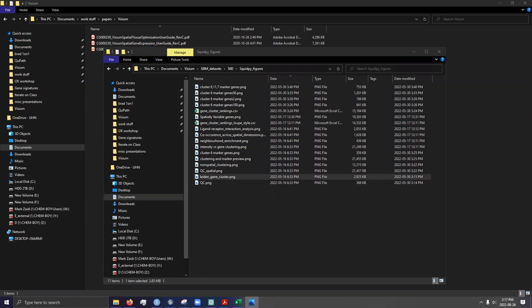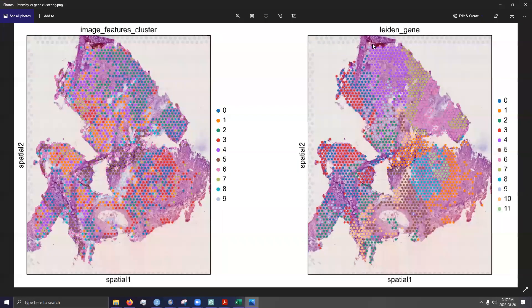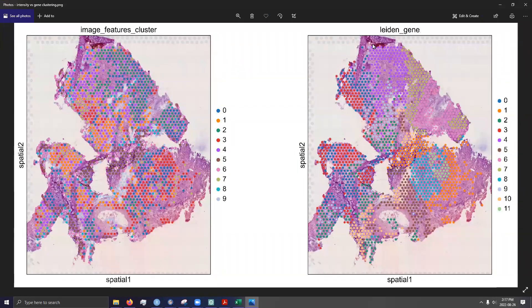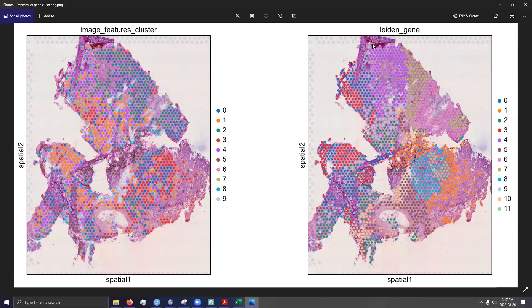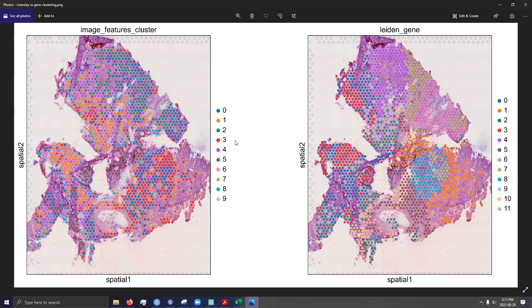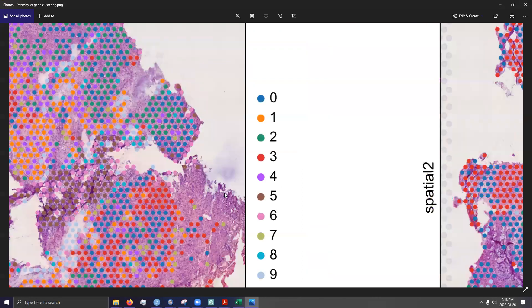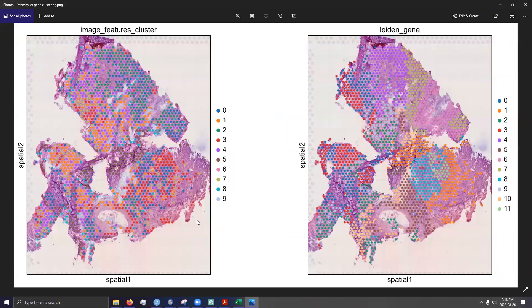Um, yeah, so I mean, the purposes of encoding histological information into your tissue section means you can actually run clustering, not in the gene expression space shown on the left, but actually using image features. So now points of a cluster, they might not share similar transcriptomic profiles, but they will share similar histological features. So the features that I generated here were things like just mean red, green, and blue channel intensity within spots. And that was just a feature I kind of appended on a dataset.